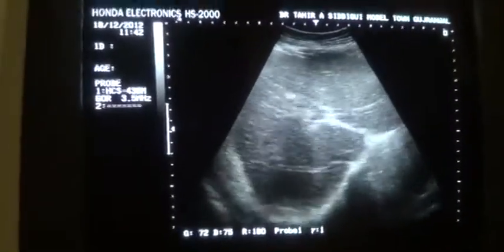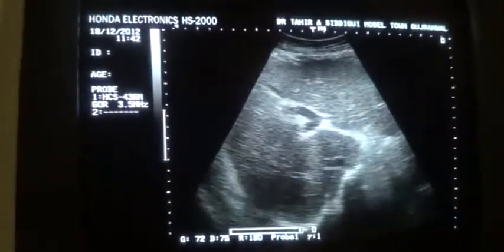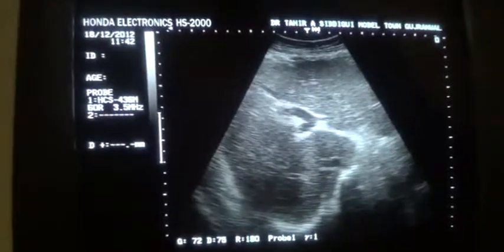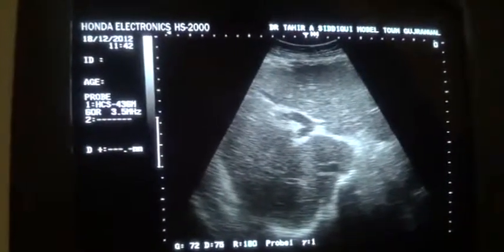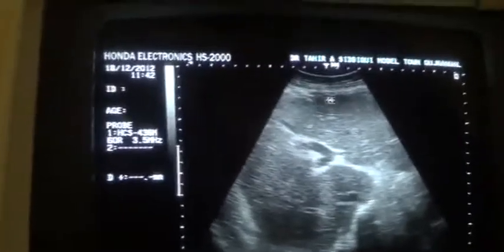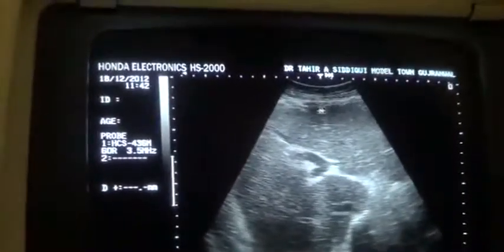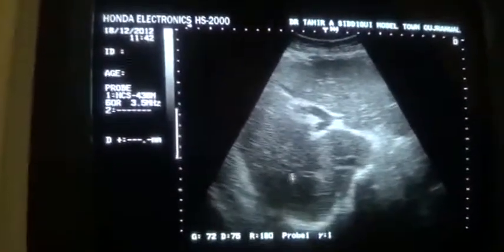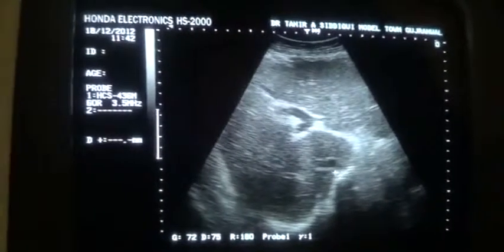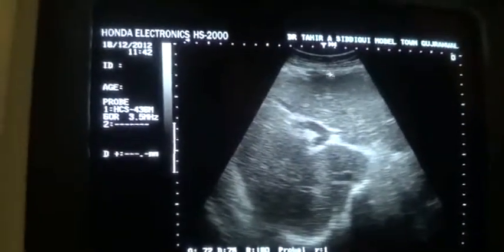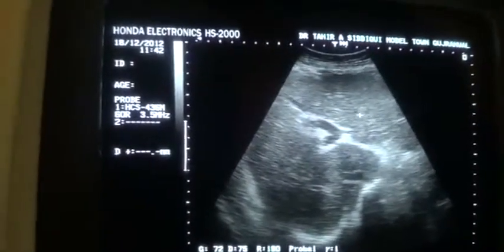Remember that in the majority — not all, but the majority — of cases of cirrhotic liver, this is identified as cirrhotic because you see that the outer surface is irregular and the texture is coarse. This is the left lobe of the liver in transverse section.